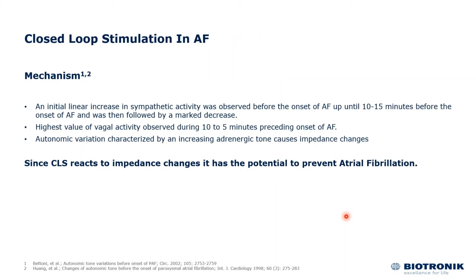So if you have a look at this, patients with closed loop stimulation in atrial fibrillation, we do know that, I'm sure many of you have heard before, some of the papers have come out and been shared with many of us, talking about rectal or digital rectal stimulation terminating atrial fibrillation. There's a real concept behind this, because we do see that before patients start having paroxysms of atrial fibrillation, there's a surge of sympathetic overdrive. And this sympathetic overdrive will translate to increased cardiac contractility. And this will increase the RV impedance, and again will be picked up by the CLS pacemaker.